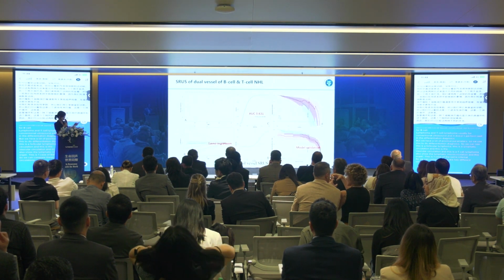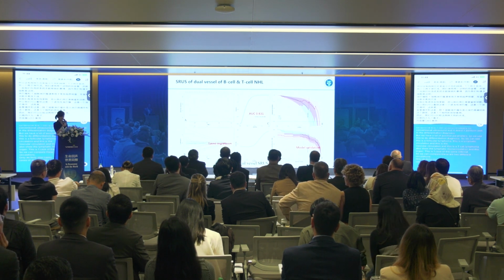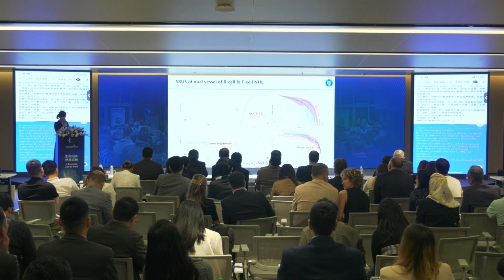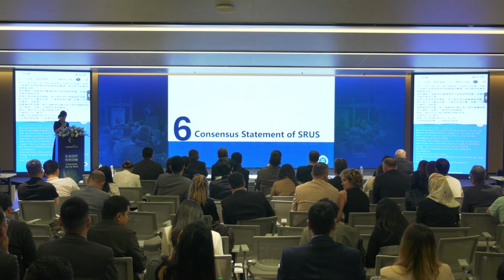We did 49 cases of dual vessel SRUS, and we achieved an AUC of 0.8. I think it's a very good performance of this technique.